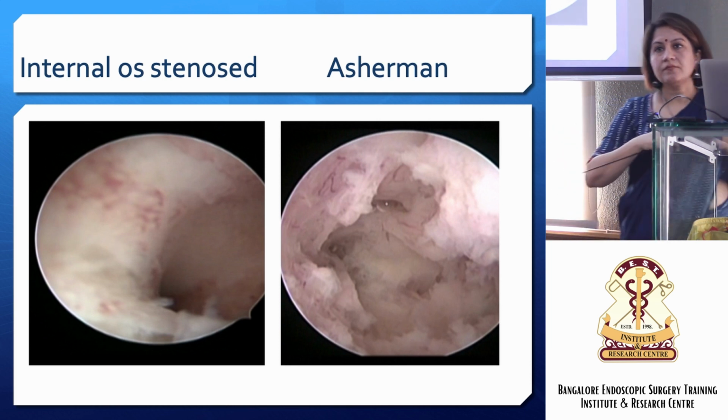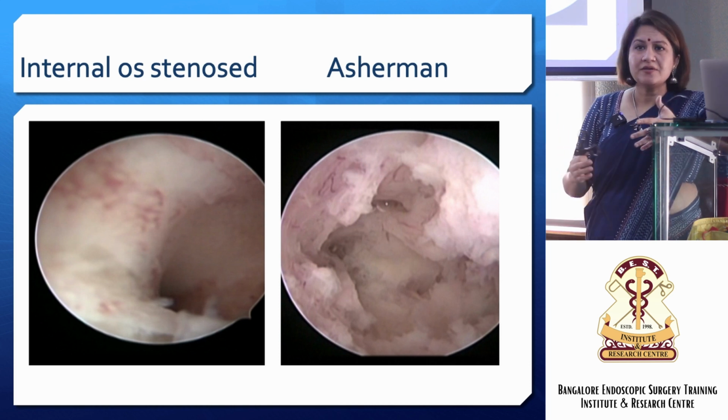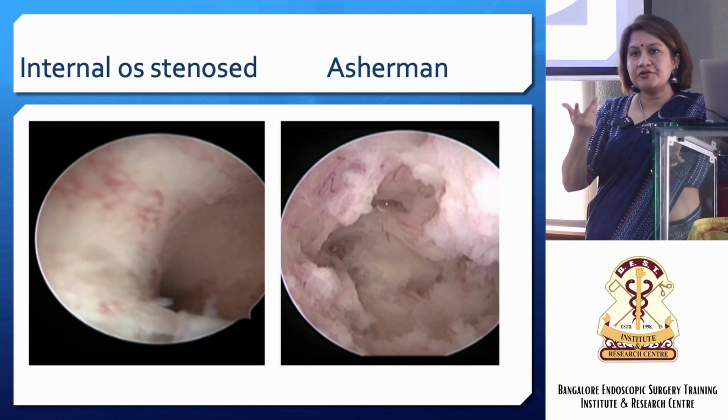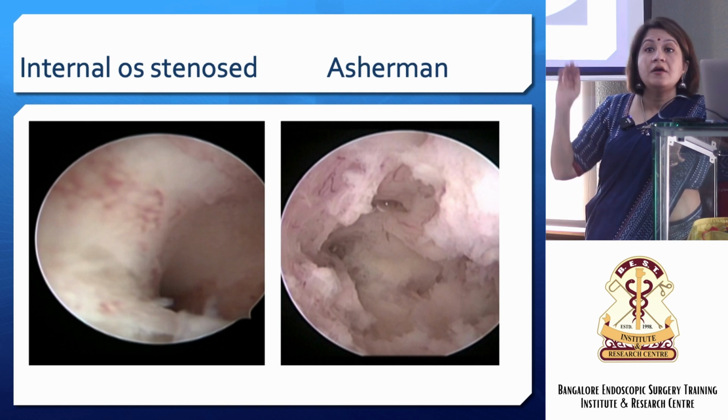I put a scope for that patient because we just couldn't figure out where we were, and under ultrasound also I thought I'd put a, and suddenly I felt I don't know, in the myometrium, or I had perforated, or I'd gone into a lateral pelvic wall. I just couldn't figure out where I was. So I put a scope for her.